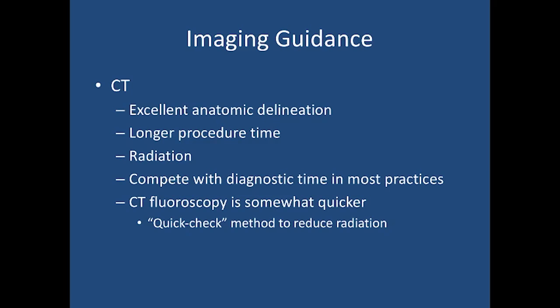CT, of course, provides excellent anatomic delineation, but just generally takes longer than ultrasound-guided procedures. It of course involves radiation, and in many practices, there isn't a dedicated CT scanner for interventions, and as such, when a CT-guided procedure is performed, it is taking away from diagnostic time as well. CT fluoroscopy is available in many units and is somewhat quicker than the general technique of going in the room and coming back out to image.